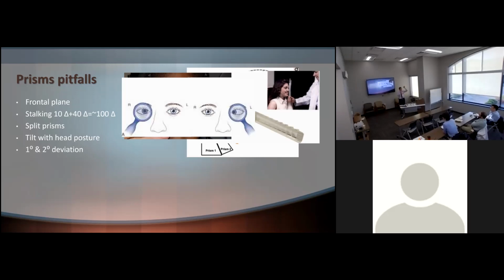We are trying to blur her right eye by not wearing contact lens here, but even with uncorrected vision in the right eye, she still has a tendency to try to fixate with this eye and induce significant hypertropia on the contralateral eye. So again, find the paralytic or the restricted eye, and put the prism in front of this eye.